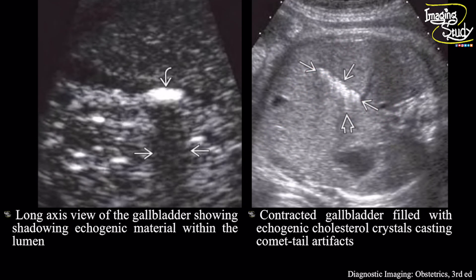Another picture of the gallbladder in longitudinal section shows the hyper-echogenic luminal structure casting posterior acoustic shadow. It's very difficult to say from this image whether there is a single stone or multiple tiny stones at a single point. On the right image, you can see the hyper-echogenic material-filled gallbladder lumen showing some comet-tail artifacts indicating the content as cholesterol crystals.